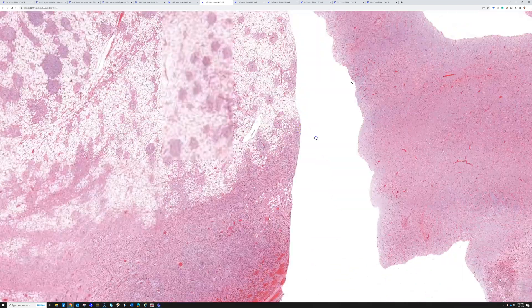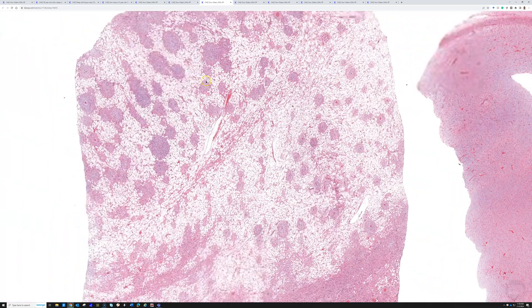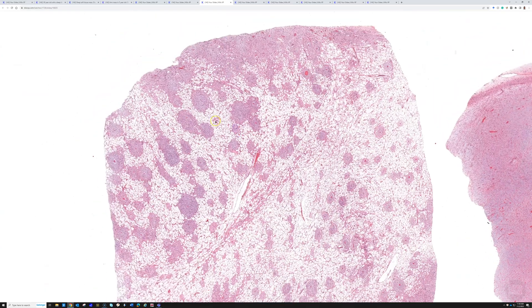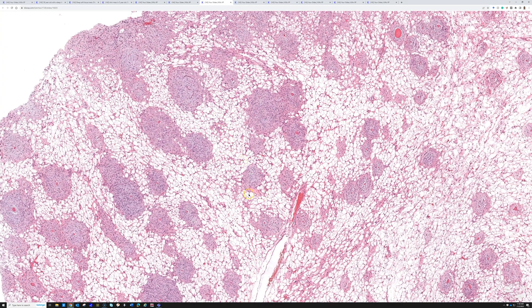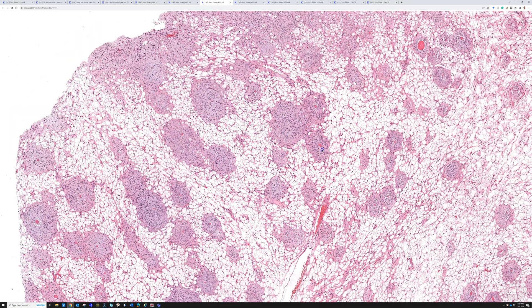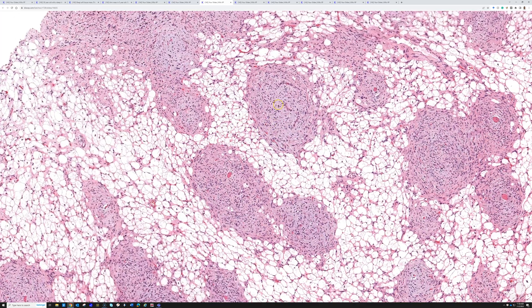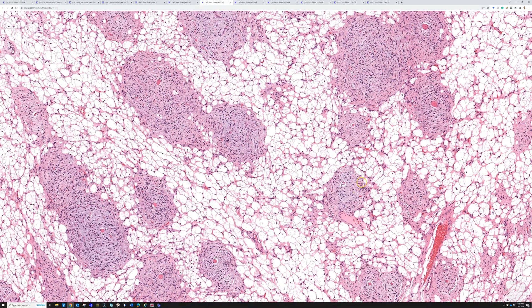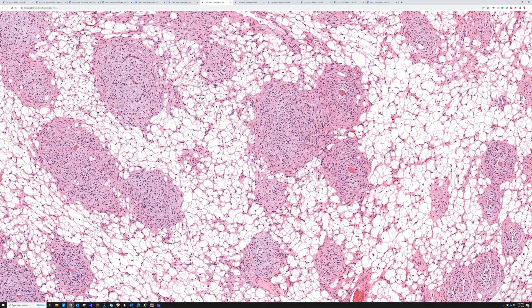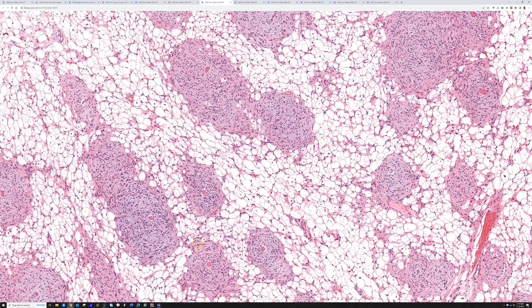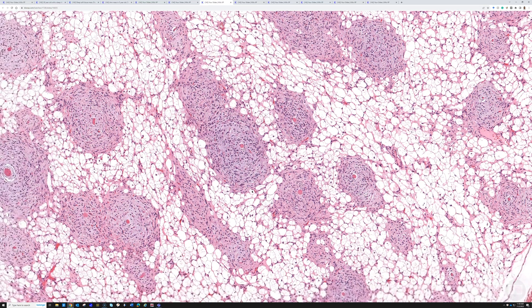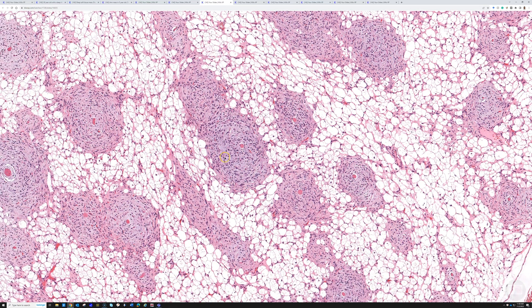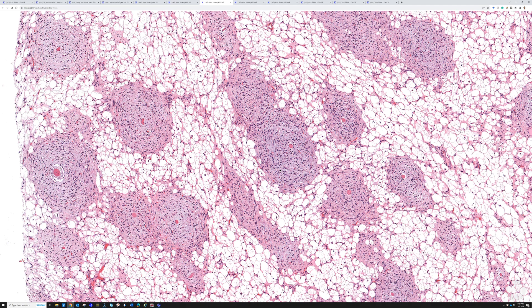Now, the real reason I wanted to show you is because this is a fascinating and unusual pattern I only get to see occasionally. Here we have these whirled, swirled areas of spindle cells, with a little bit of myxoid background. These fall into the category of what's called meningothelial whirls, because it resembles the whirling you see in a meningioma. In this case, we're getting whirls of the de-differentiated liposarcoma - meningothelial whirl pattern, a well-described but relatively uncommon morphologic pattern in de-differentiated and sometimes well-differentiated liposarcoma.